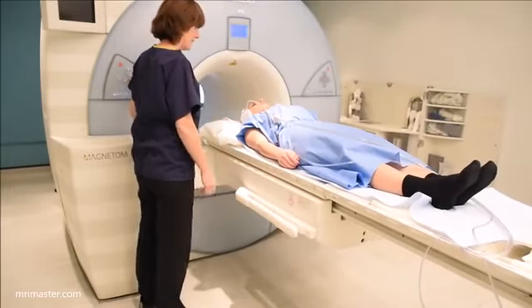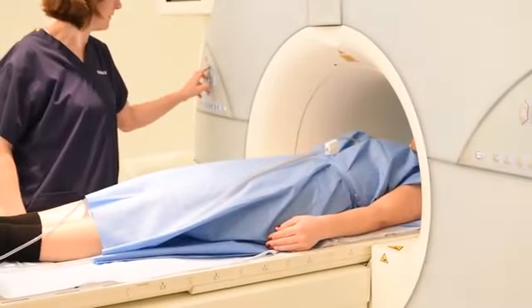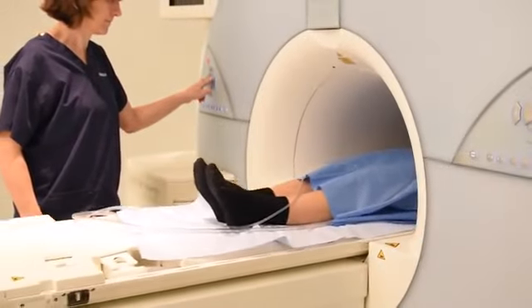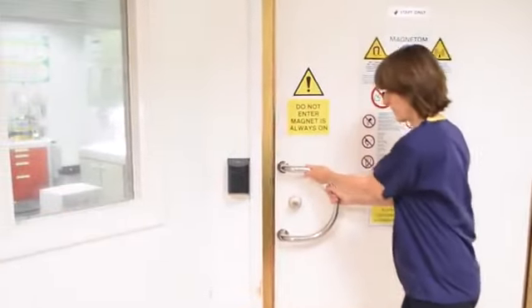Carefully move the patient into the scanner and center 4 inches or 10 centimeters above the iliac crest. Now move the patient fully into the bore of the magnet. Ensure that the patient is calm and comfortable before leaving the room.